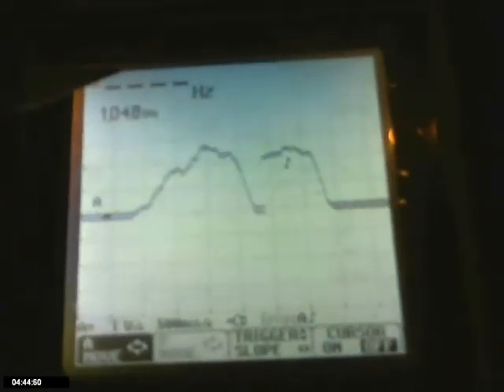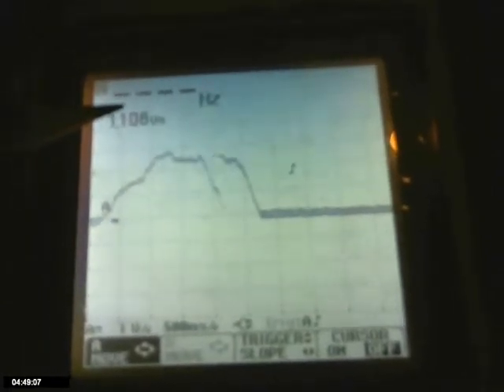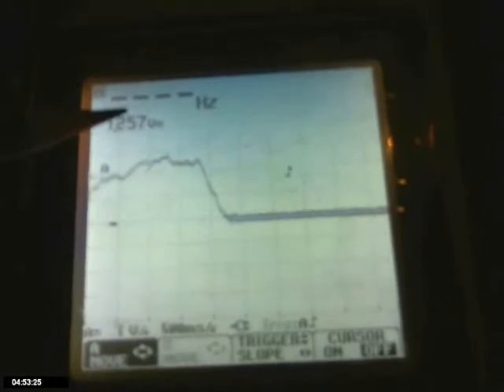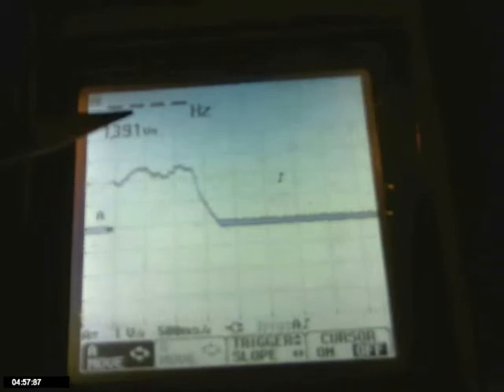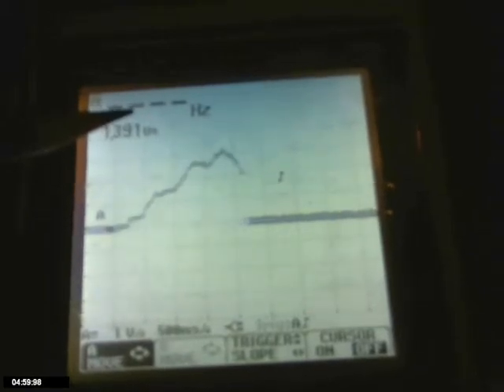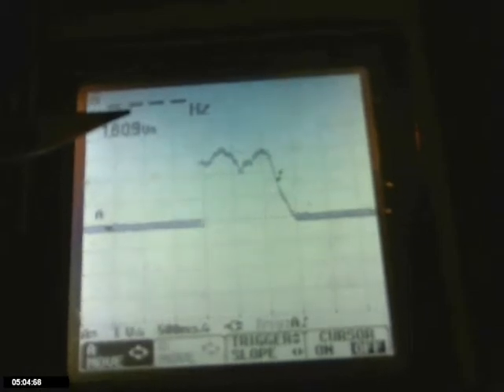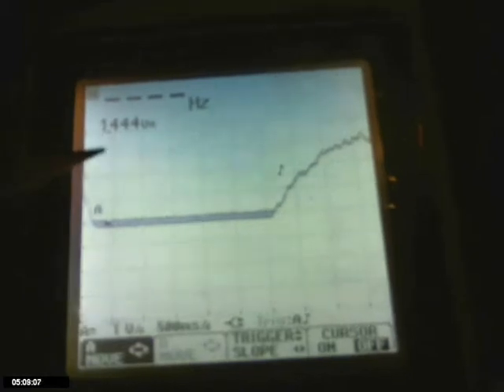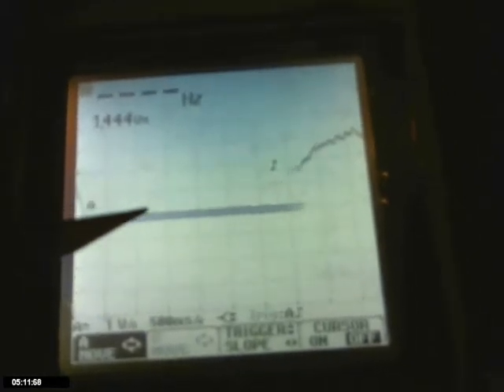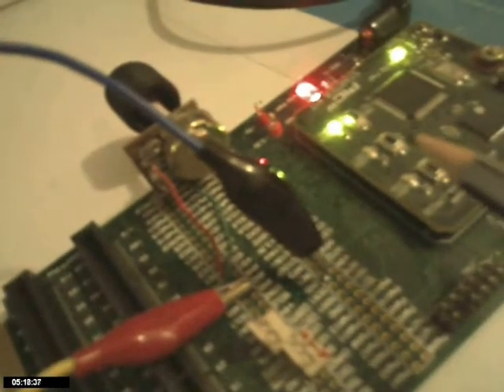When you go down on your breath, you're trying to breathe very slow, which usually happens when you fall off into sleep or your senses are very slow and you are sliding into some sort of dozing or sleeping. You'll find that the curve changes and you have a larger time period. And there you see the green lamp glowing over there.